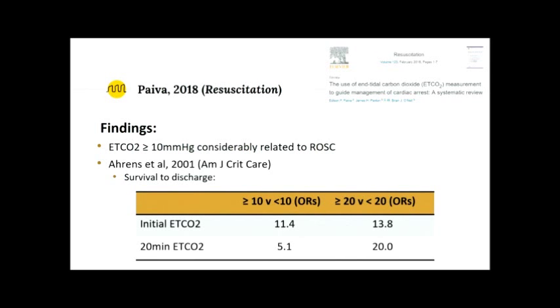Now they did have a challenge in the heterogeneous definition of what an initial end-tidal CO2 is. So in certain papers, does that mean initial as first arrival into the emergency department, immediately after intubation, and if that intubation doesn't happen right away, does your initial then become a random time point? So well-structured review, but challenging information to work with.